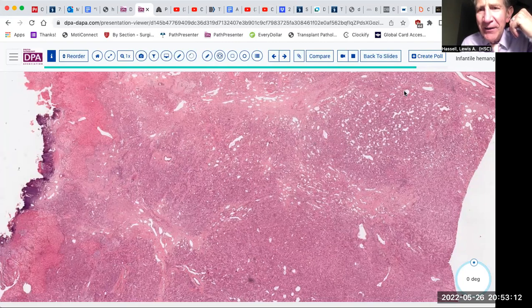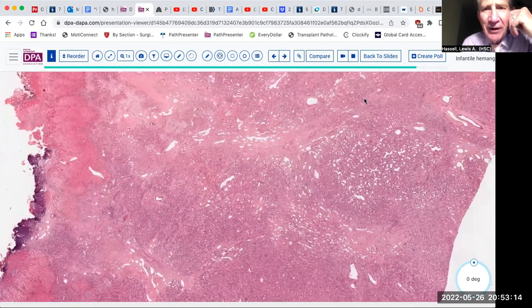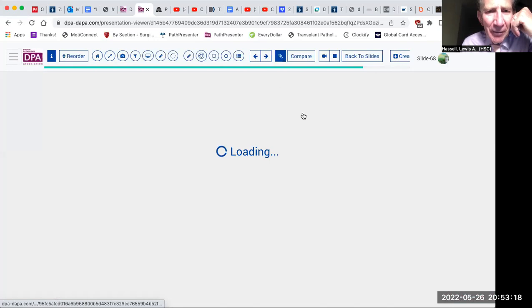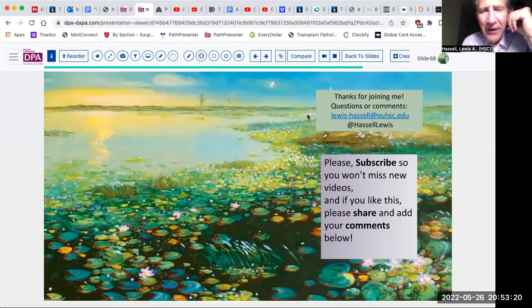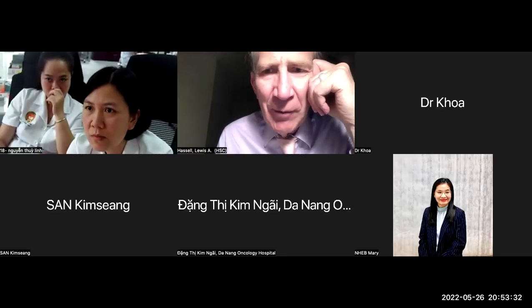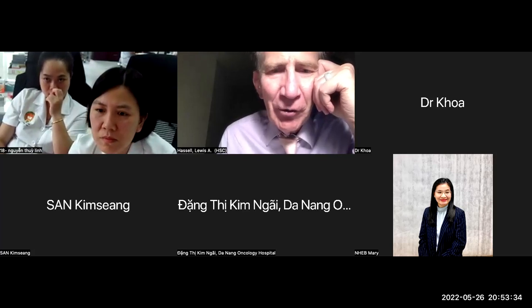So that kind of wraps up our tour of the hepatic tumors that I had prepared. As I've indicated, I will send you the link for the video as well as the link for the slides so that you can study these on your own. But if there are questions at this point, I'd be very happy to answer any of your questions.